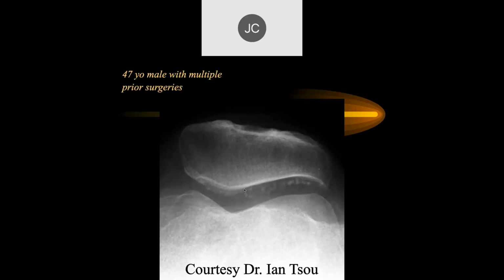Except for known soft tissue masses, I don't really think there's ever a medical reason to do with and without contrast. Yeah. Soft tissue masses or infection are really the two indications. Almost always when we get those orders, I think it's for someone who doesn't understand how to order an MR examination, and they're ordering the wrong study.